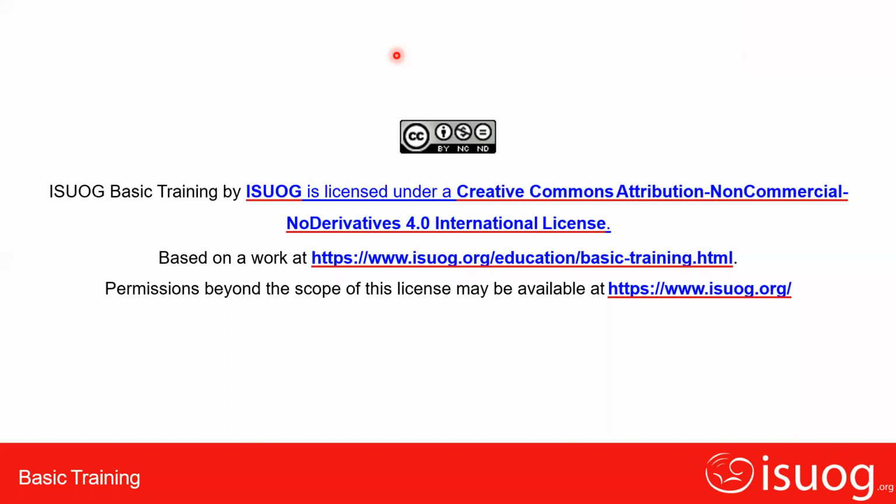At most, you might find a small volume stomach. If you find a small volume stomach, you start getting suspicious and you wait and watch it for an hour, 2 hours, 12 hours, and 24 hours. A persistently small stomach will tell you something is wrong either with the swallowing or with the communication between the upper part of the digestive tract and the stomach.